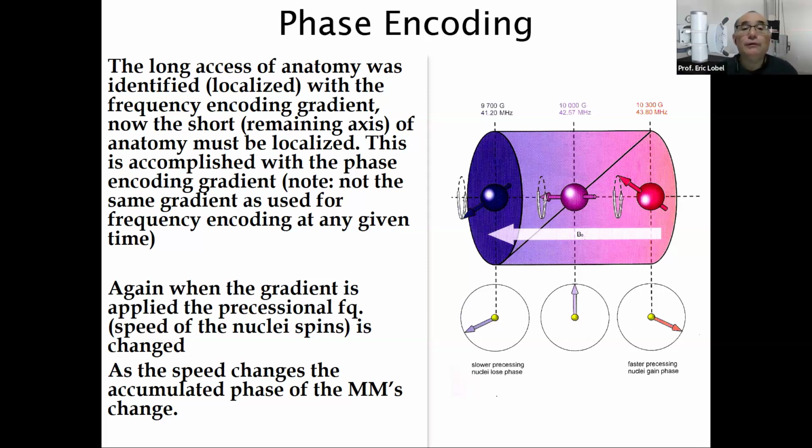Each line is going to contain the information from an echo. How do we decide where each echo is placed? Because one of the things we'll talk about in another lecture is it's important to fill K-space for one, but K-space and where an echo is placed will also determine the contrast versus the spatial resolution ratio, right?